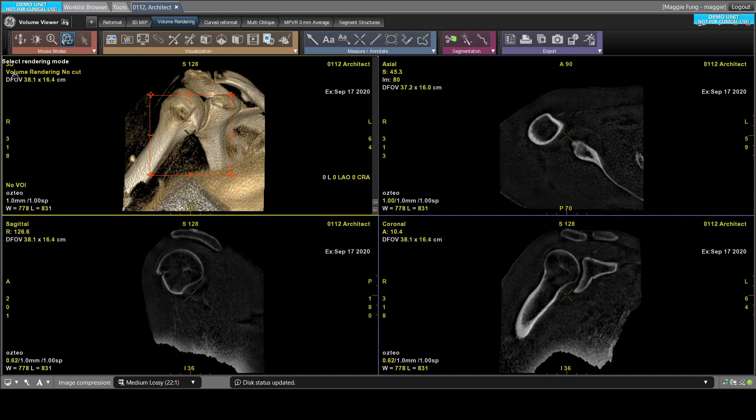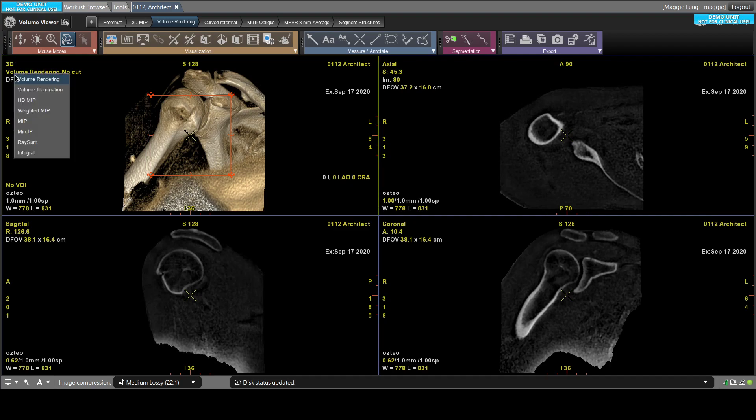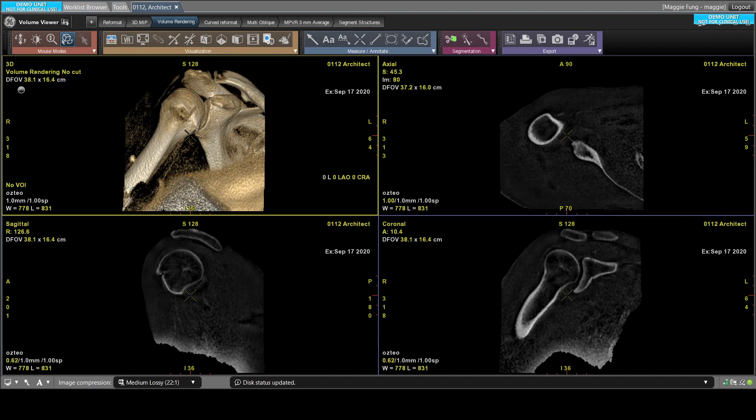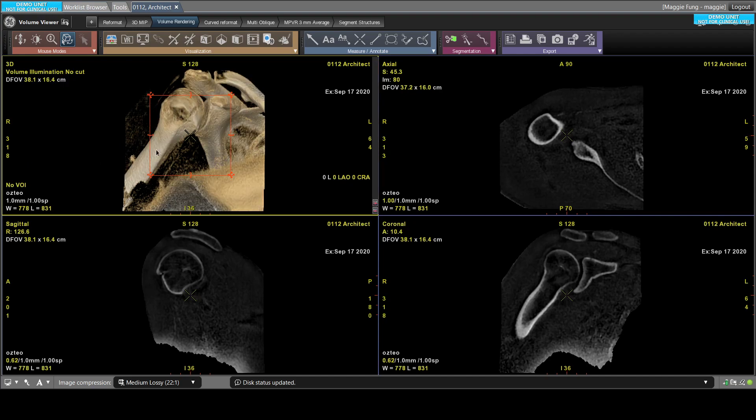There's also a new feature called volume illumination that gives you a more realistic view for volume rendering. So if I switch to that feature, you'll see that it just feels a little bit more realistic because of the depth of the volume rendering.